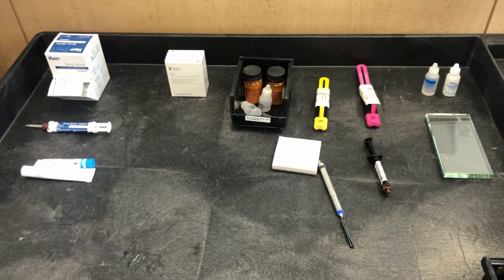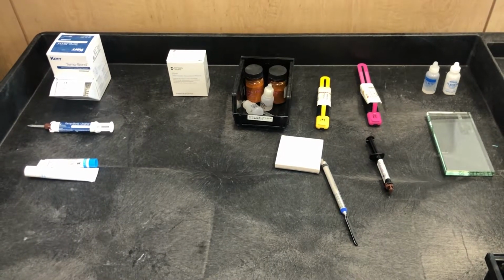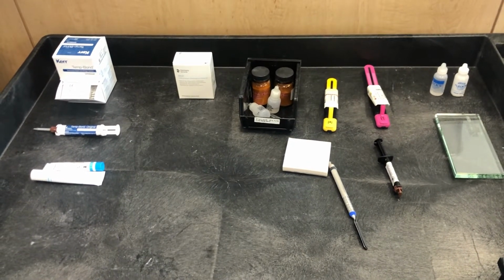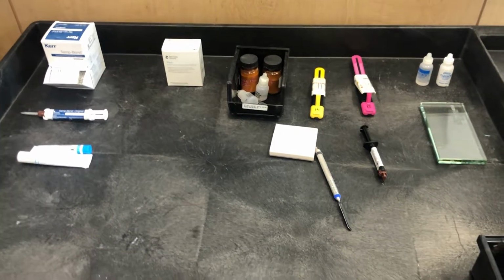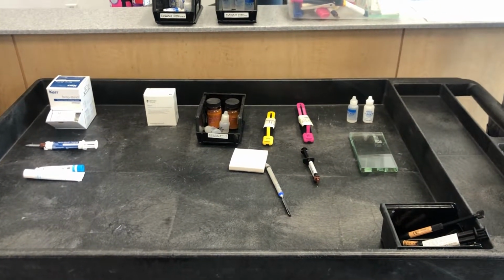And yet, when Dr. Thorell and I went through school, it was standard. It was the best permanent, if you will, cement that we could use. It had a high compressive strength. It was prone to create a little bit of sensitivity because of its acidity that usually calmed down within a day or two. You'd say to the patient, this tooth may be a little bit sensitive for a few days to temperature change and that kind of thing.